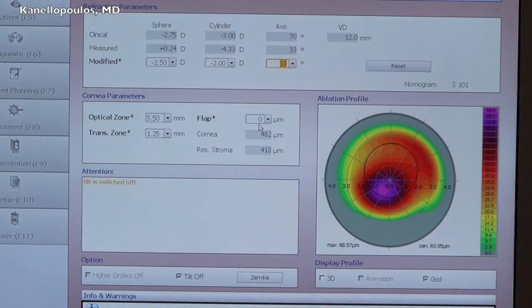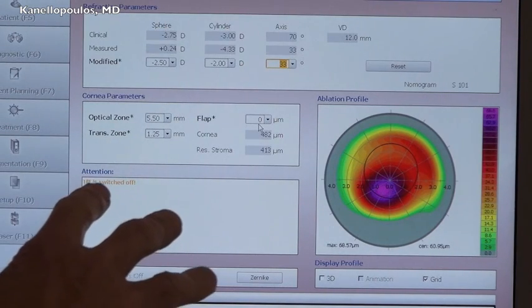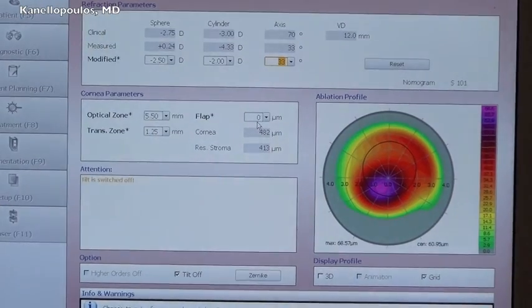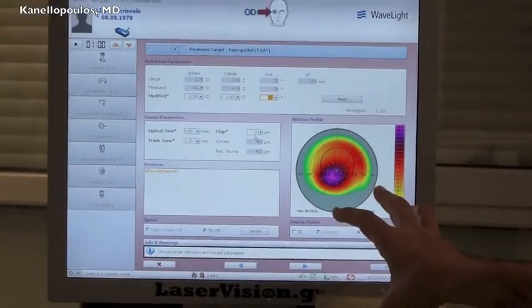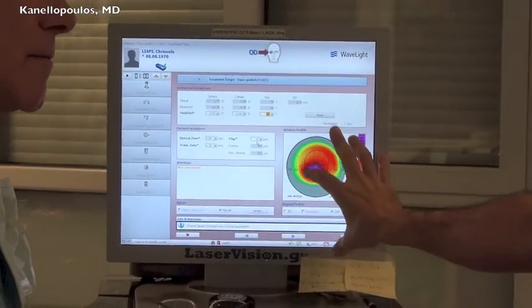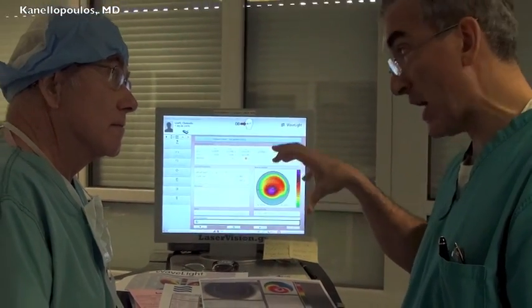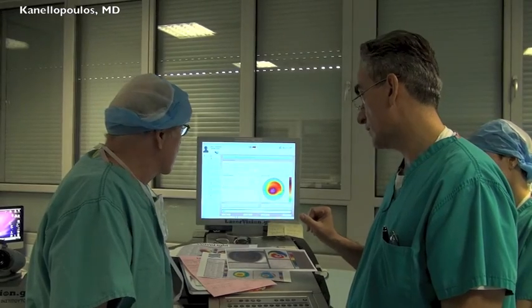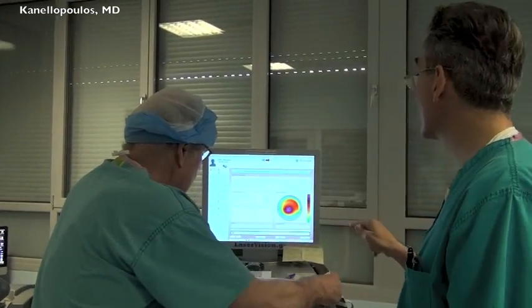And this represents then an average of the 4 placido topographies that we did. So the average of the 4, taking out the outlier and then averaging the remainders. The only advantage that we see now with the placido disc images is that this will be able to be also tracked according to the cyclotorsion of the eye. So this may have a potential advantage, and we're going to store this as well.